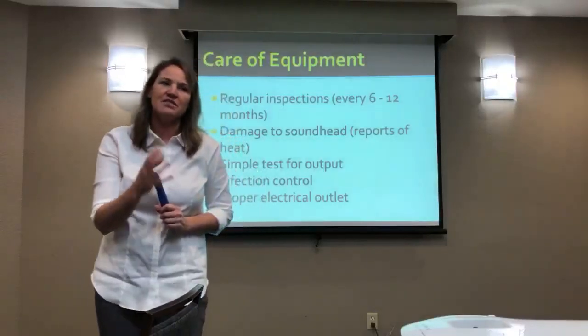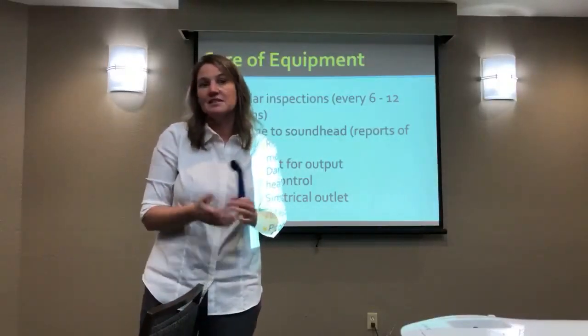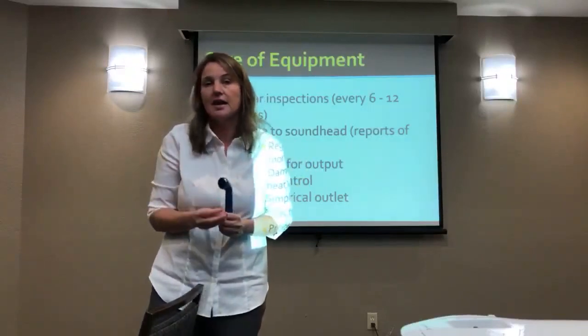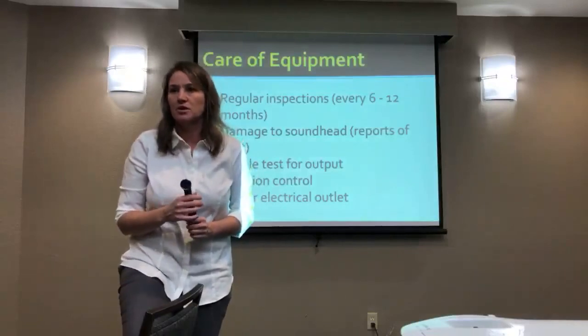So some machines have these safety precautions that are meant to protect you from damaging it, or if it's accidentally left on or something like that. But just avoid exposing it to air and then you won't have any problem whatsoever.